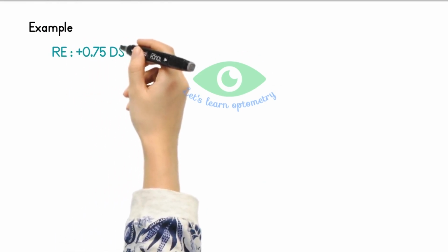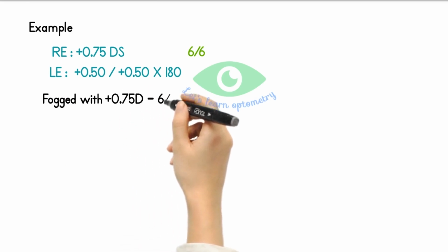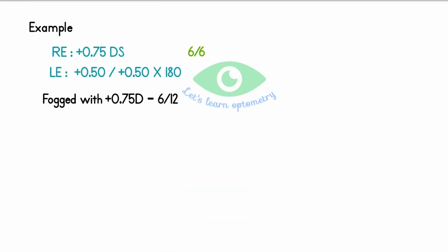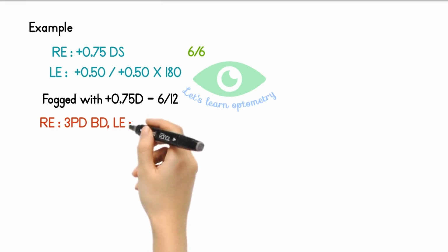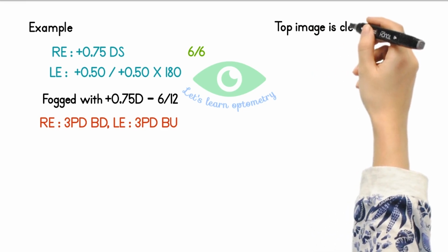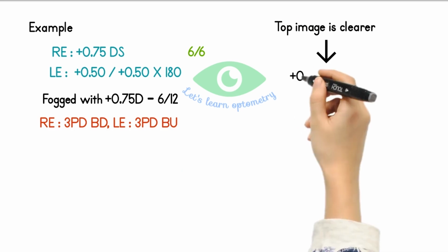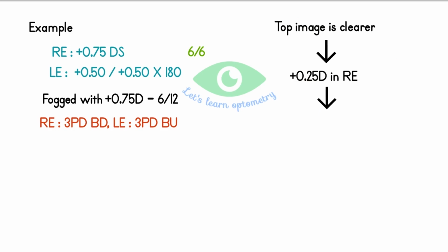Example, the monocular refraction value, right eye plus 0.75 diopter spherical, left eye plus 0.5 spherical with plus 0.5 cylinder at 180 degree axis. The BCVA in both eyes is 6/6. So you fogged with plus 0.75 and the lens blurred to 6/12. You introduced 3 prism base down in front of right eye and 3 prism base up in front of left eye. The patient sees two images and they say top image is clearer than the bottom one. The top image belongs to the right eye, so you add plus 0.25 in front of right eye. Now patient says both images are equally blurred, so we balance the accommodation.